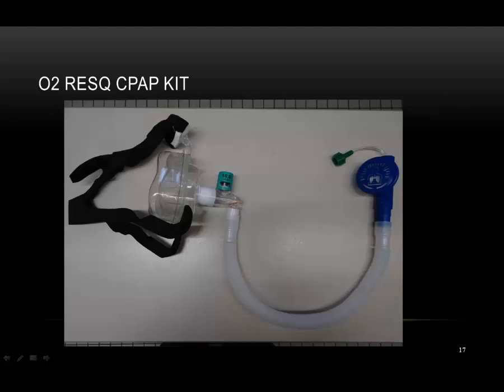In order to maintain circuit pressure, it is important to keep the CPAP valve open. Therefore, there will always be some flow through the valve even during patient inspiration. This can be verified by examining the valve disc during inspiration or by placing a hand over the valve exhaust port to ensure that there is flow during both breath phases.